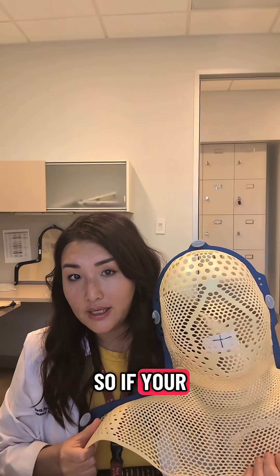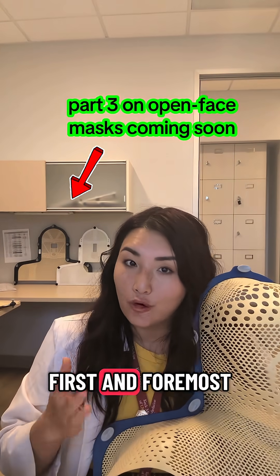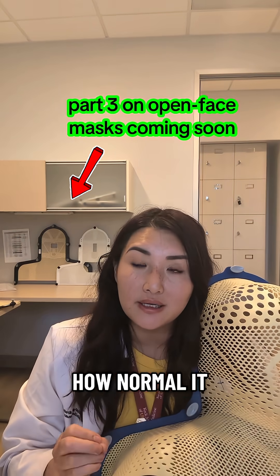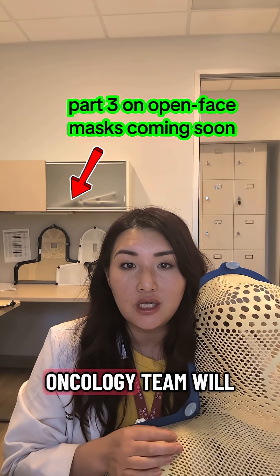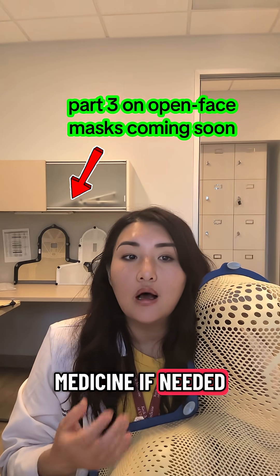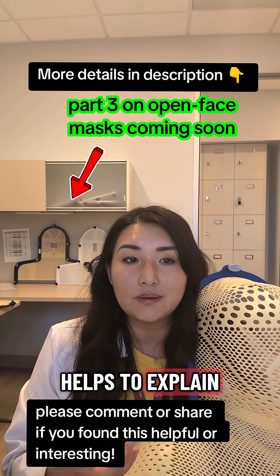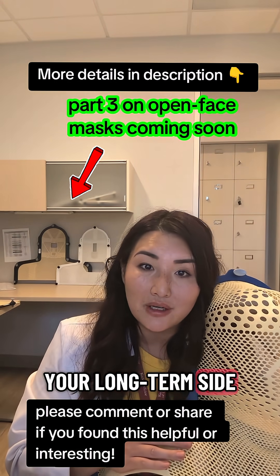So if your radiation oncologist is planning on using mask immobilization for your radiation, first and foremost, I want to stress how normal it is to feel anxious or claustrophobic. Your radiation oncology team will help you through it by talking to you, playing your favorite music, or giving you medicine if needed. But I hope this video also helps to explain the why — by braving this mask, you are reducing your long-term side effects from radiation.